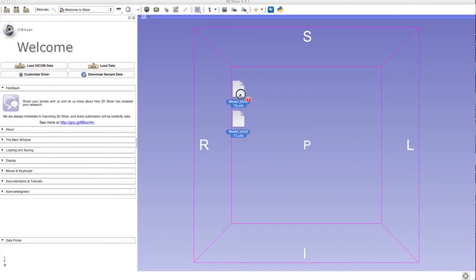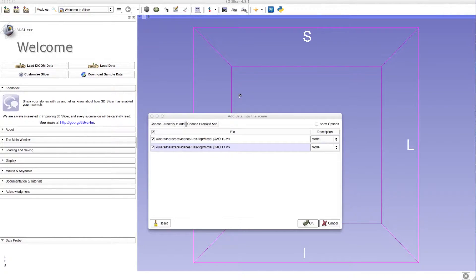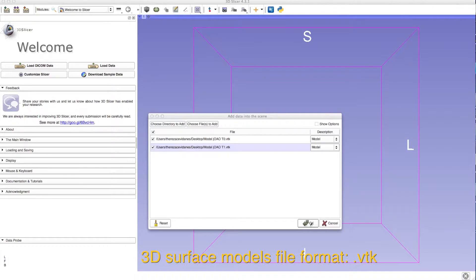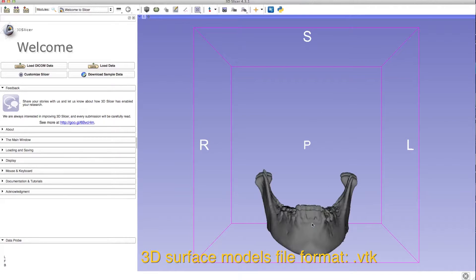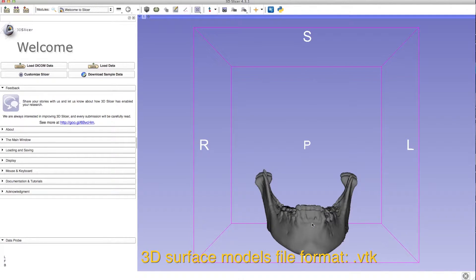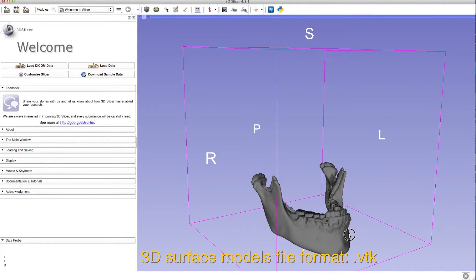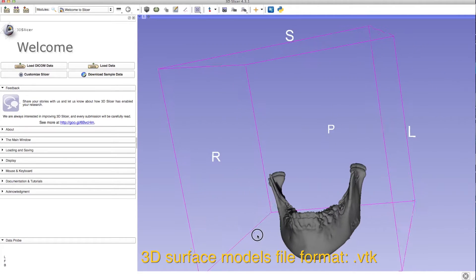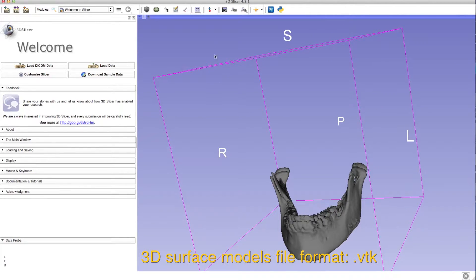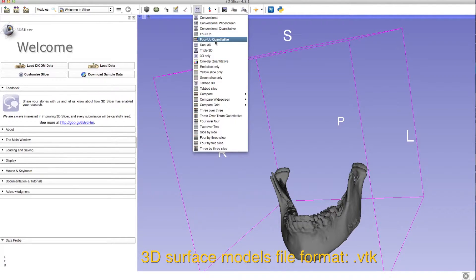Load the time point surface models into 3DSlicer. You can always change the display.